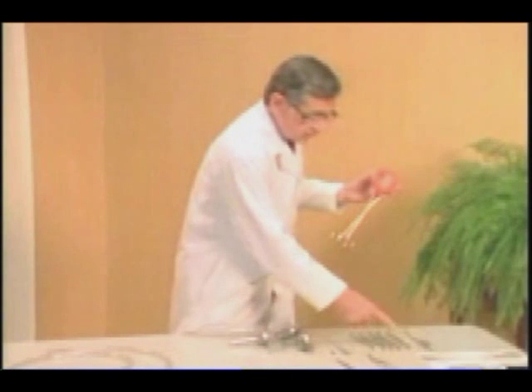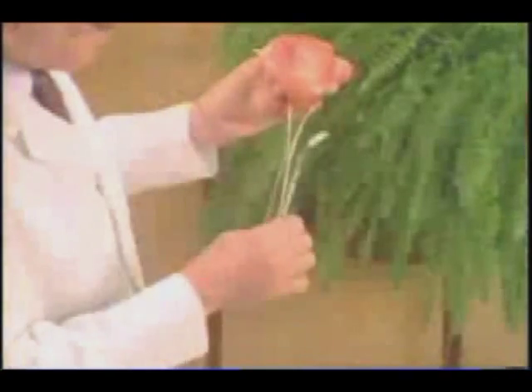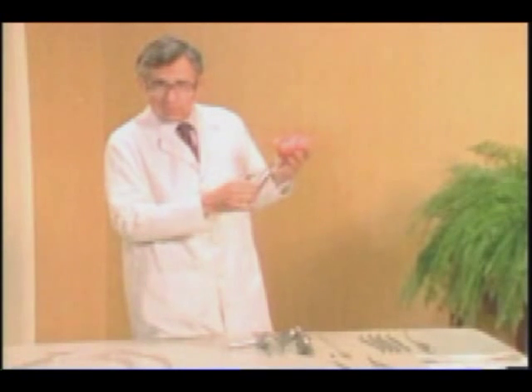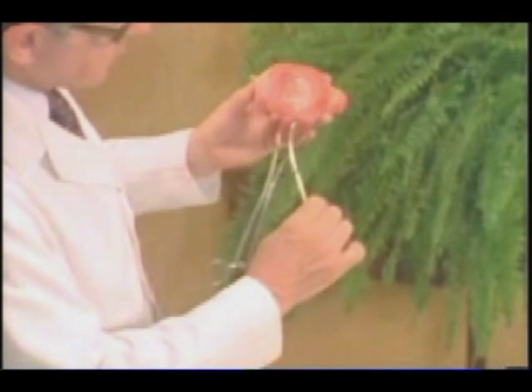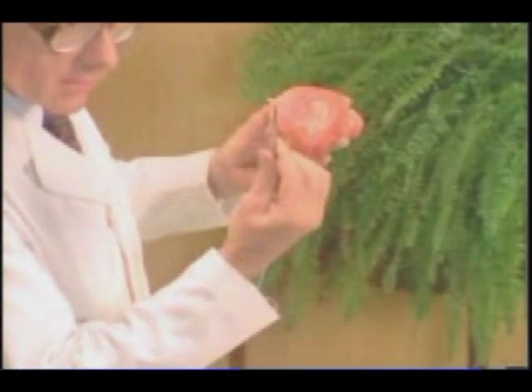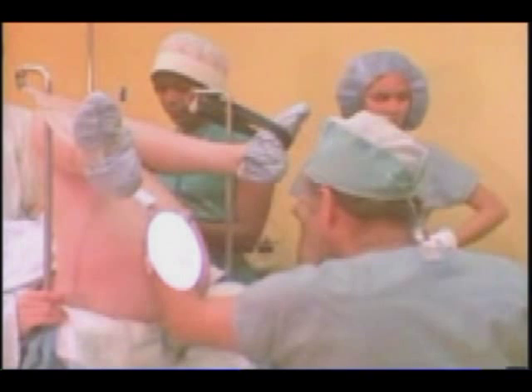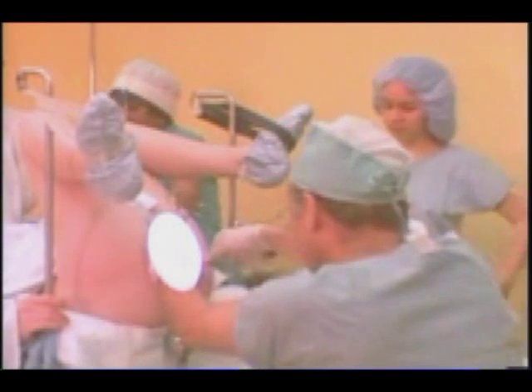And then this set of dilators, these metallic curved instruments, are used to effect the opening of the cervix in order to introduce, finally, the abortion instruments themselves. The abortionist first introduces the most slender of these instruments into the cervix to dilate the cervix, turns the instrument around to a slightly larger end, introduces that end, and then works his way through the various graduated, increasingly larger ends of this dilating instrument.